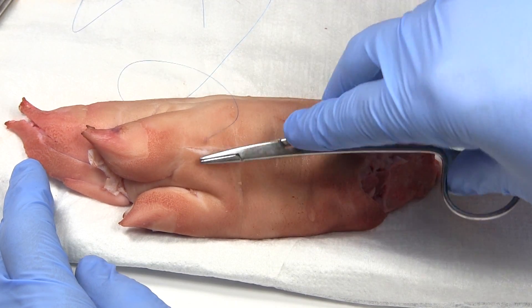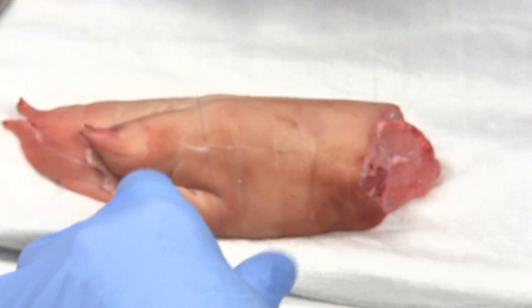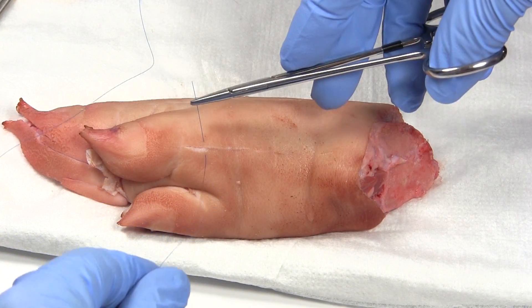Push it through, then pull it most of the way through — leave a little bit of a tail.